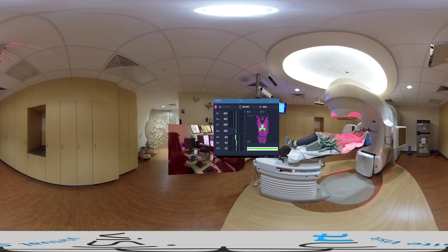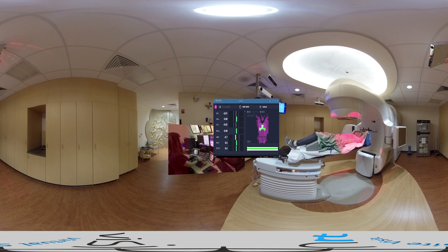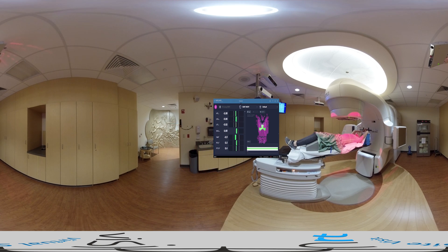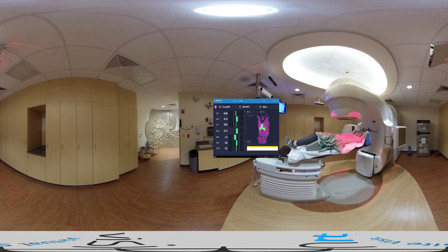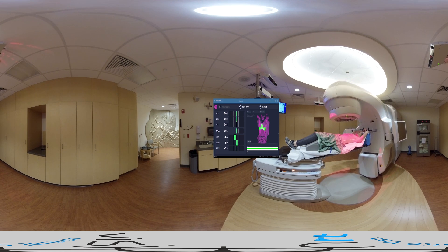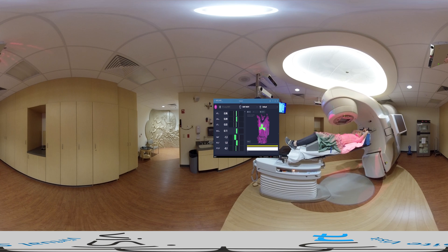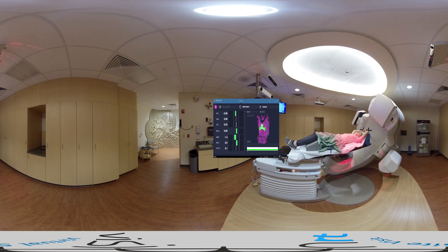We then do radiographic imaging to look at internal anatomy positioning. We continue to monitor the patient in AlignRT to ensure they don't move during imaging or while images are being reviewed. After image shifts are approved and applied, a new session reference surface is captured. The region of interest and any required couch rotations will automatically propagate to the new acquired reference surface. During treatment, we use this new surface to monitor the patient's motion for today only.